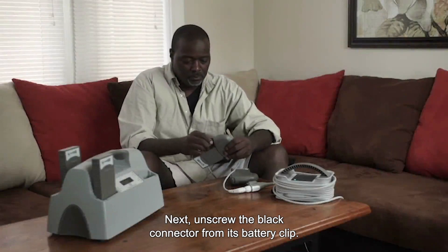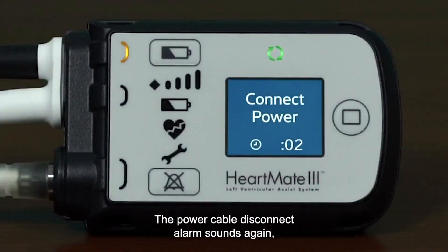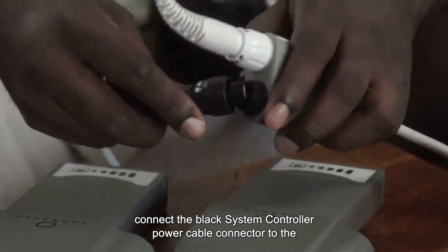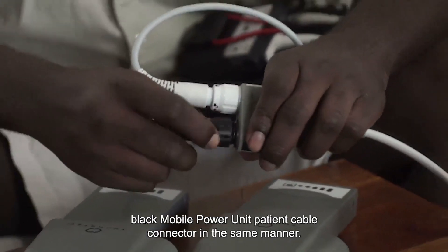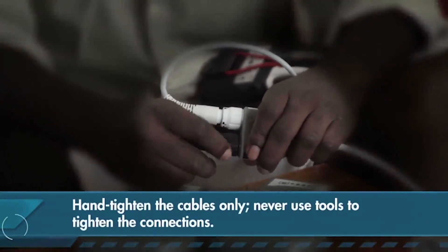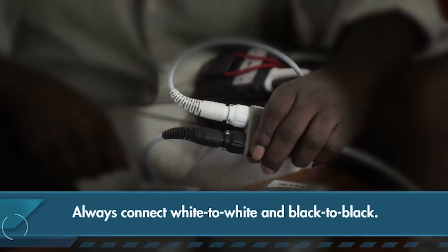Next, unscrew the black connector from its battery clip. The power cable disconnect alarm sounds again. Connect the black system controller power cable connector to the black mobile power unit patient cable connector in the same manner. Hand tighten the cables only — never use tools to tighten the connections. Always connect white to white and black to black.